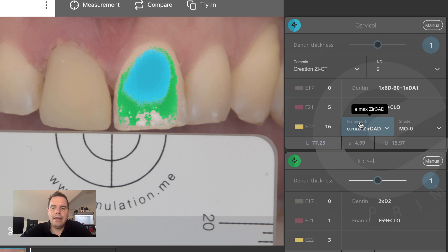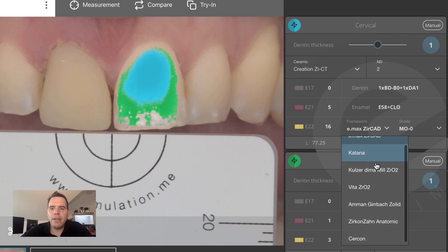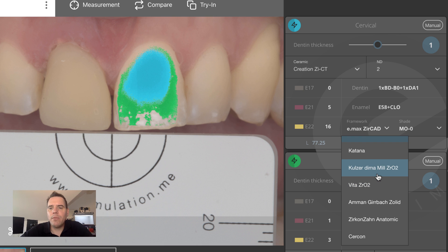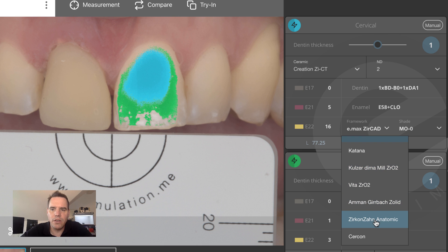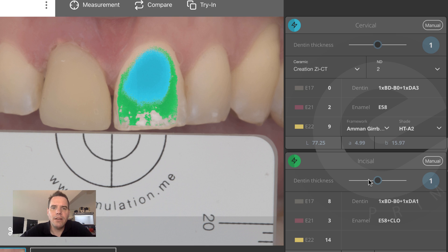Another thing we have added is you can now choose which framework material to use from which manufacturer. You simply click on framework, a drop-down menu pops up, and you can select the framework materials from a bunch of different manufacturers. If you happen to have the one from Amann-Girrbach in stock or the Zircon Sand in stock, you can select that and the mixing recipe will be adjusted accordingly.